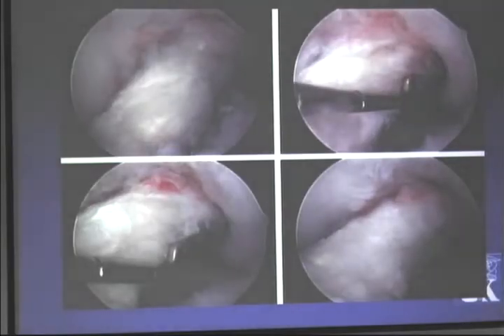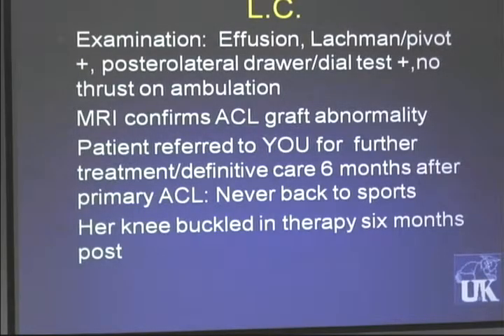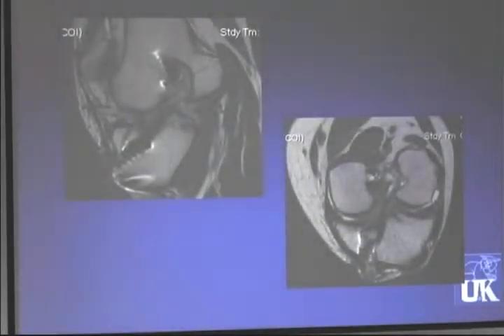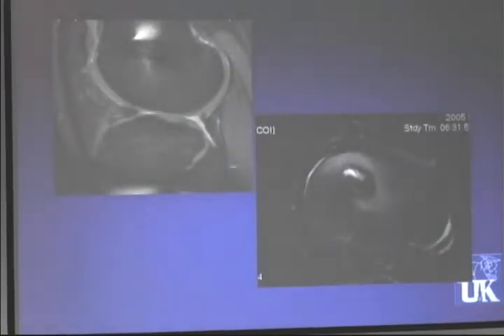So this was just cleaned up, ACL done. This is the ACL graft placed. So this is her examination at about 6 months out. ACL graft's abnormal. She's 6 months out. Her knee actually buckled in physical therapy trying to come back. So here's some MRI pictures of her ACL graft.